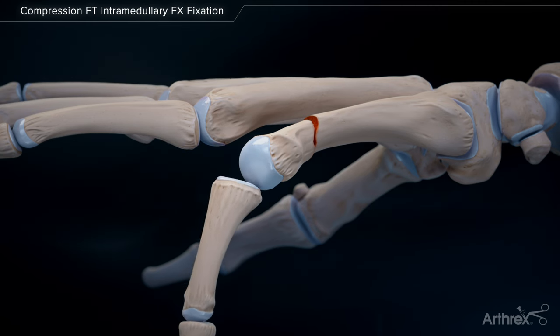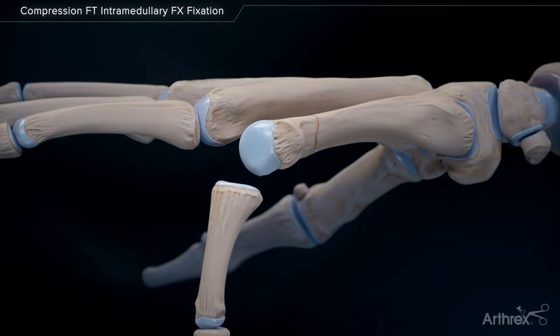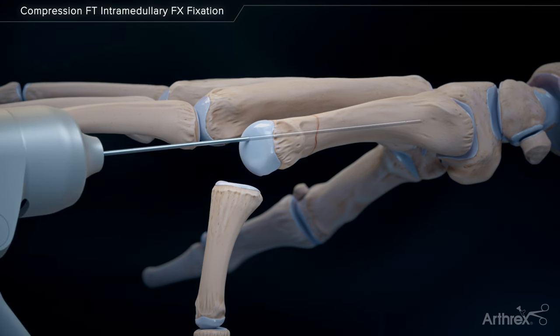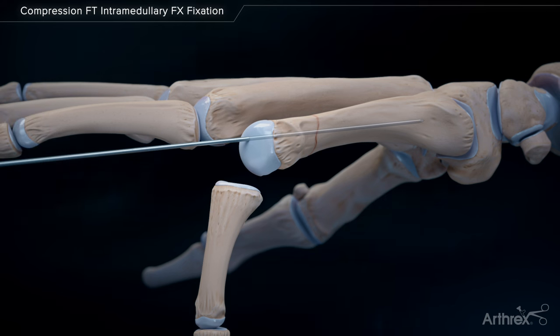The joint is flexed and the fracture is reduced. The guide wire is introduced across the fracture site, starting in the dorsal one-third of the metacarpal head and aiming down the canal.